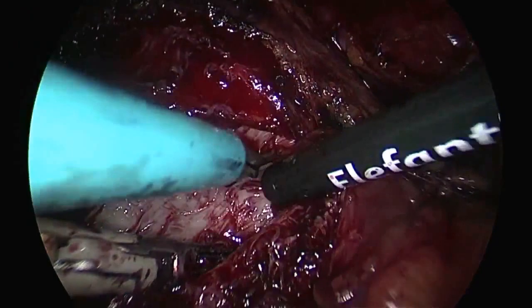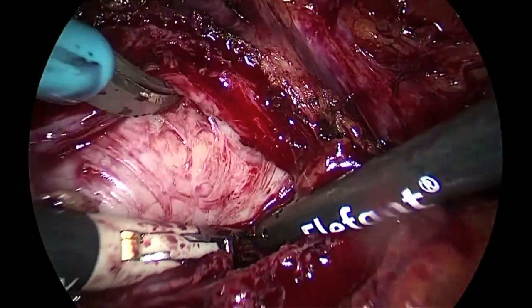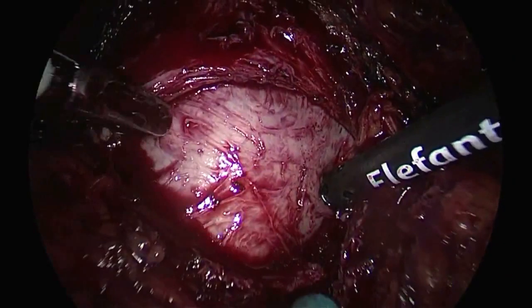Can you give me the possibility to look better? So this is the dissection plane. This is clear now? It's clear for you, Peter?